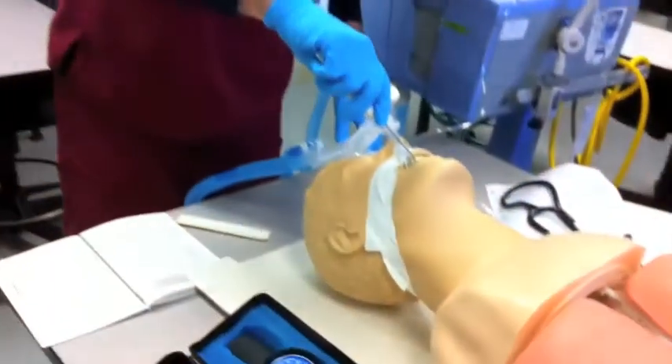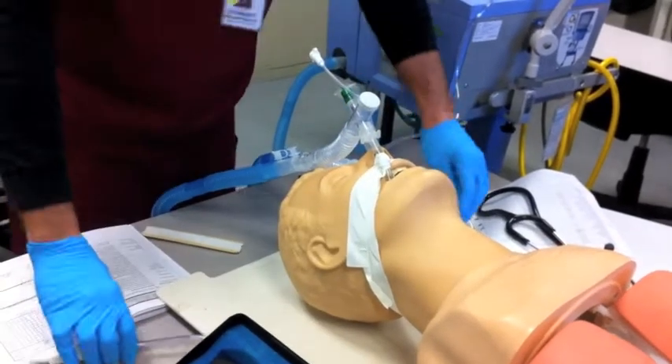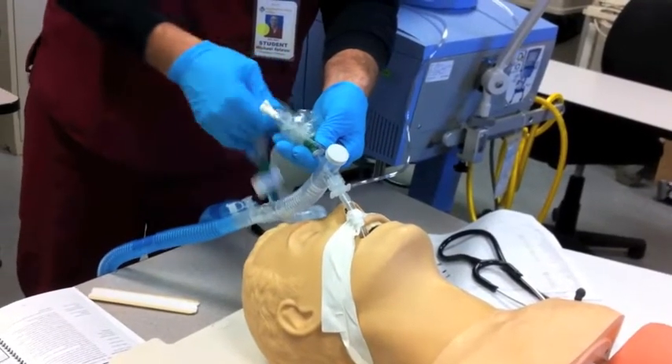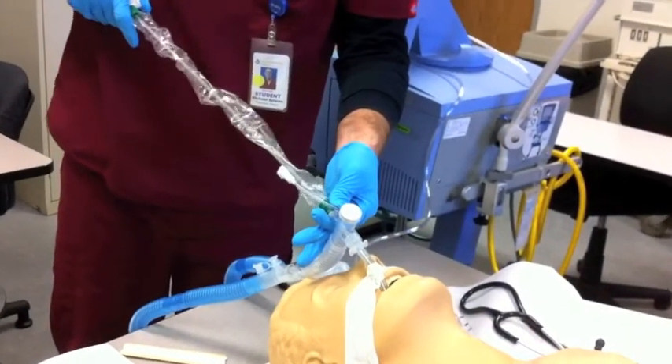Next, he's going to suction the patient if indicated. The patient has some secretions and some blood in there, so we'll suction. I'm going to suction you now — if you can cough for me, that'd be great. Secretions are coming out.